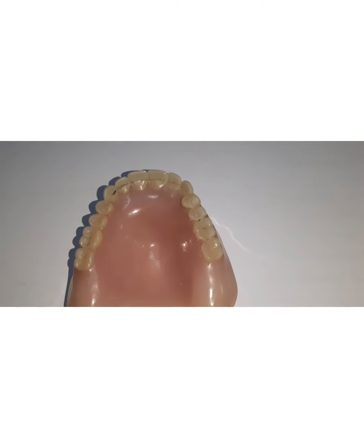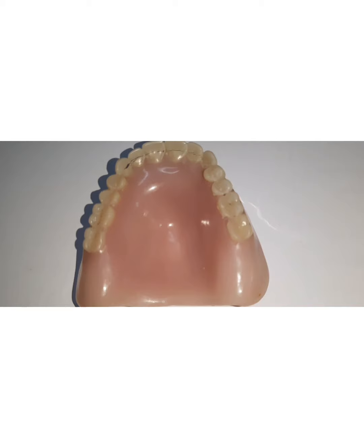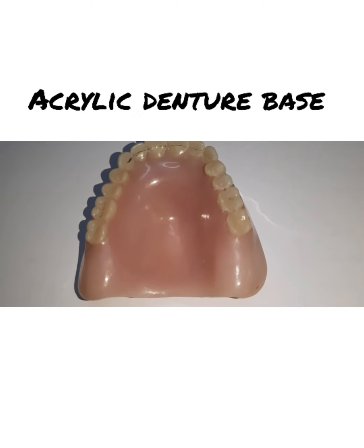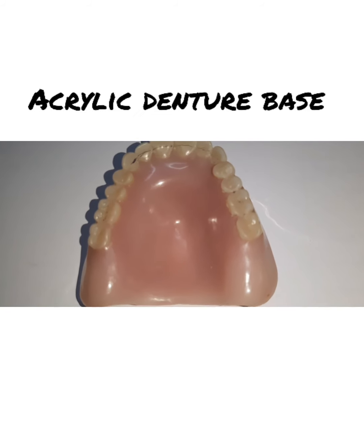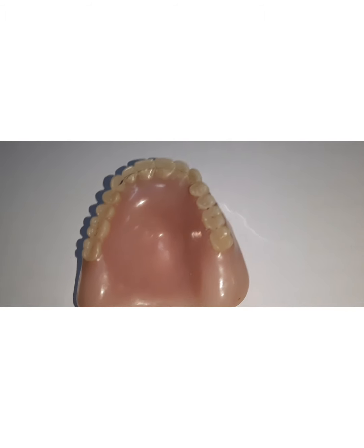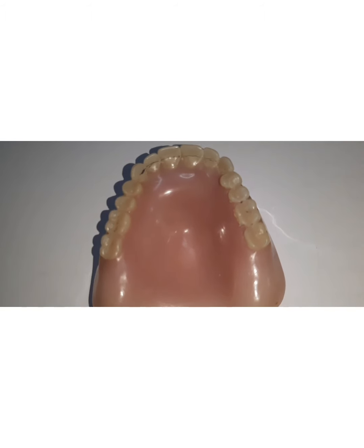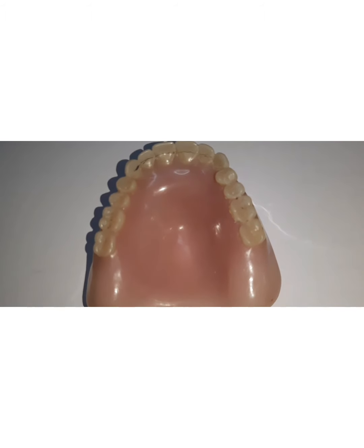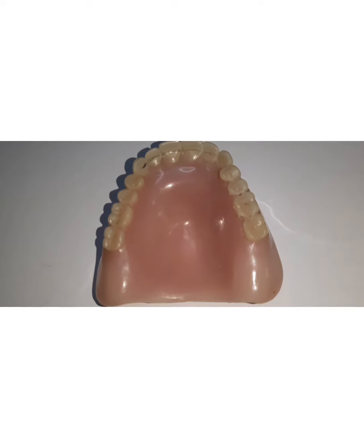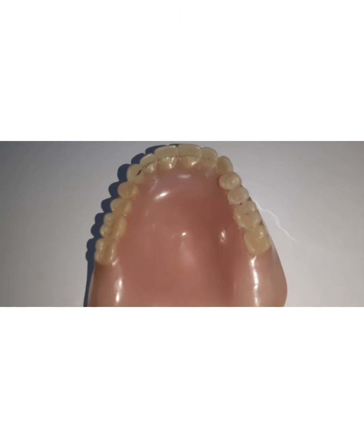As I told, acrylic denture bases are the most commonly used material to construct denture bases. Why? Because they are easy to fabricate and they are economical. Secondly, the very big advantage is they can be relined and rebased very easily. They can be characterized to increase the aesthetics, and they have adequate rigidity to resist the functional forces.